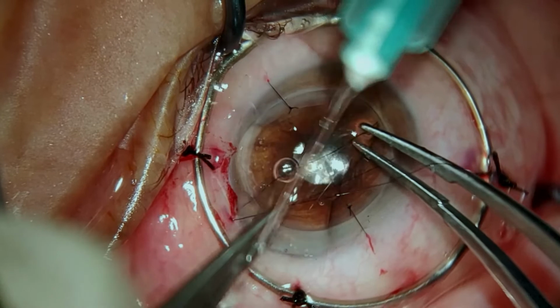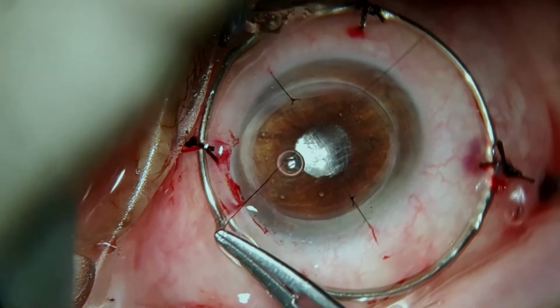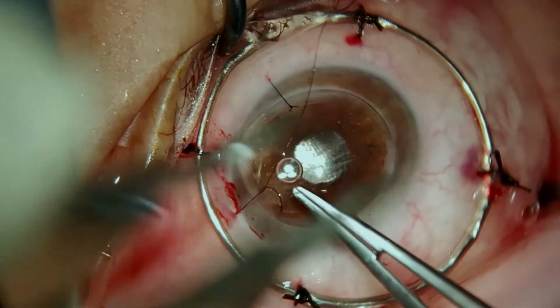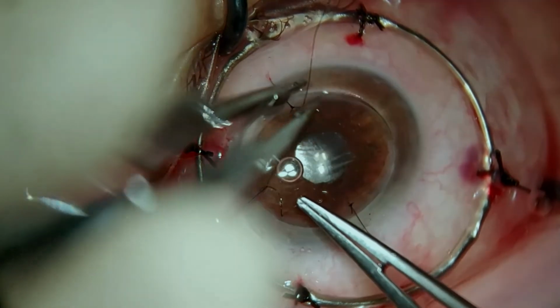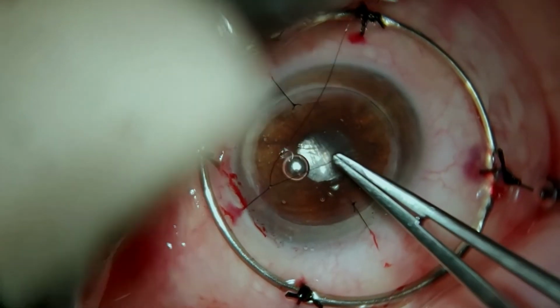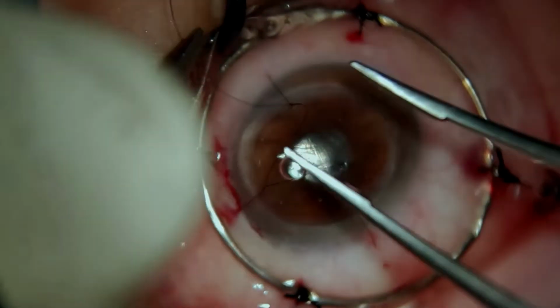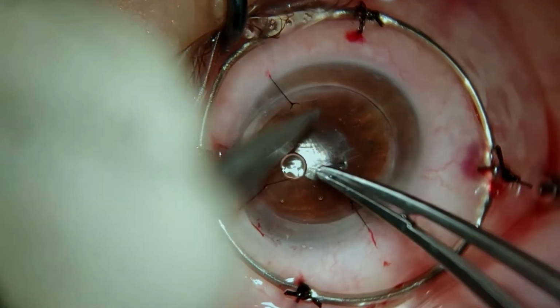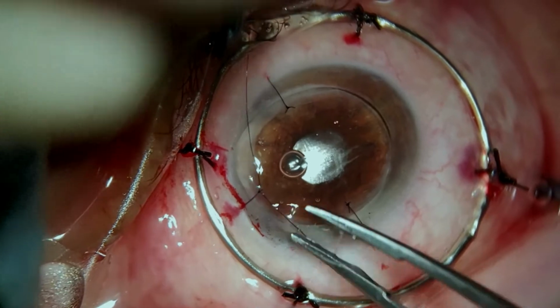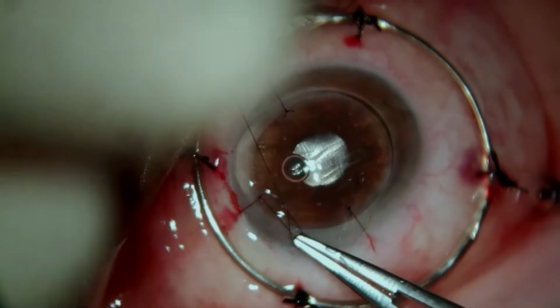Of course, you can always go back and redo these sutures anytime you're not satisfied with the way they look. You should always go back, especially if we're talking about the cardinal ones, like the first 4 sutures. These are the most significant in terms of astigmatism. So if one of them is not as you would like it to be, you should replace it on the spot, because all of the subsequent sutures that you will put will reflect and will exacerbate the astigmatism that you've created in the beginning.